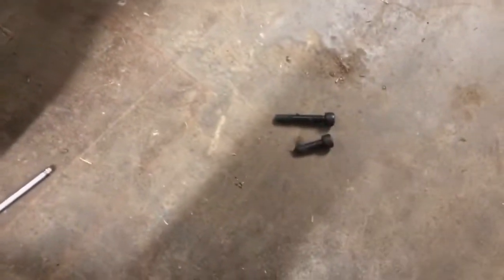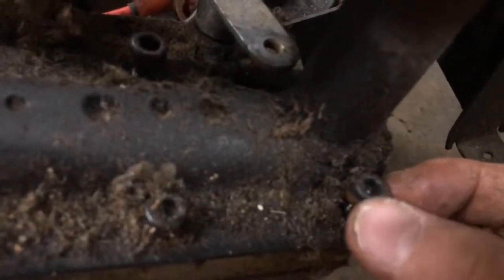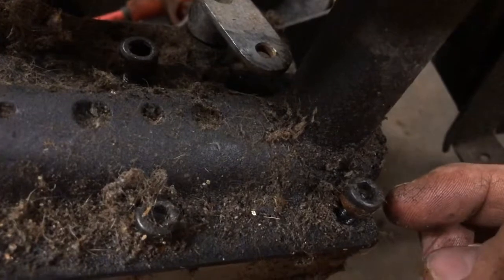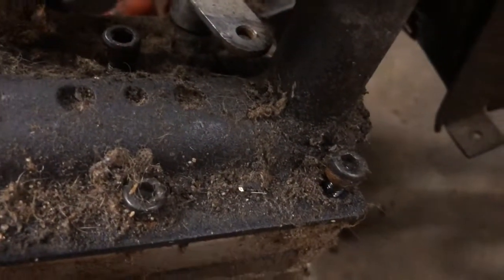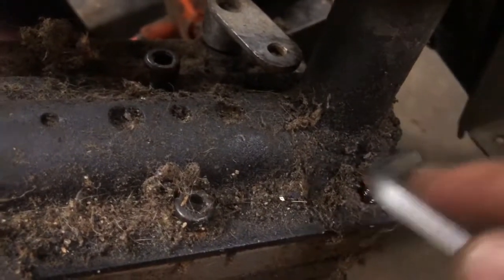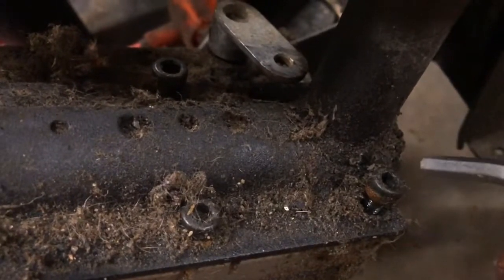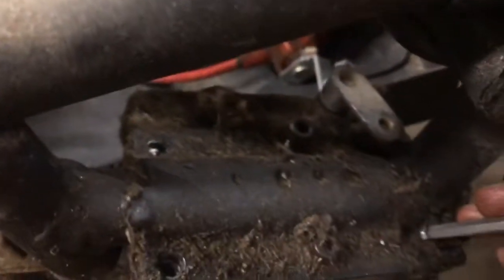There's your comparison. Also, if you're in this chair and you strip one of these, one thing you can do is have somebody get a pair of pliers, and if you haven't stripped it a lot, turn it while somebody turns it with pliers, and sometimes that will get it out. If that doesn't get it out, you have to think about drilling, which is kind of a bad spot. You may be able to get to these three. It would be extremely rough because the frame's in the way.